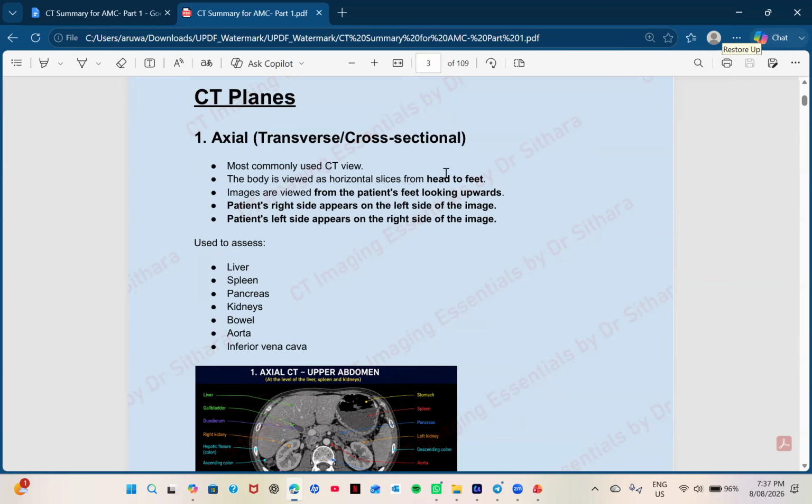Okay. So then the portal venous phase. Usually it is later, right? Sorry, doctor, this is my PDF. So we use the portal venous phase usually to visualize the portal vein system and the abdominal solid organs, right? Because you need to look at those walls. And the delayed phase is after several minutes, when the contrast starts to accumulate. It is usually useful for understanding the urinary tract lesions, those things.